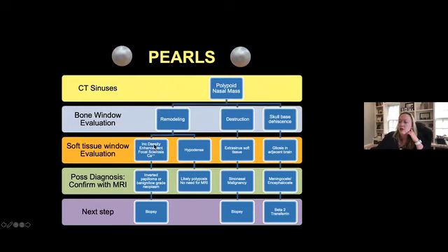If you see increased density within the soft tissues, any calcification, if it's a post-contrast image, any enhancement, focal sclerosis, that should be a red flag that you're not dealing with normal run-of-the-mill polyposis, and you could be dealing with a benign or low-grade neoplasm because it's causing bony remodeling, and you should consider a biopsy.